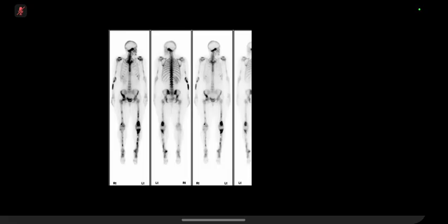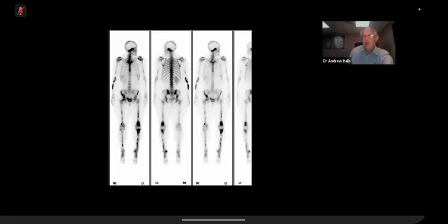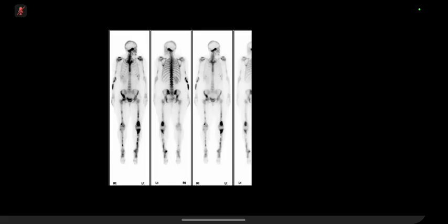Yep. Yeah. So, it wasn't trauma. Anything else it could be? Well, it could be a metabolic disease, something of course systemic. Could it be inflammatory arthritis possibly?